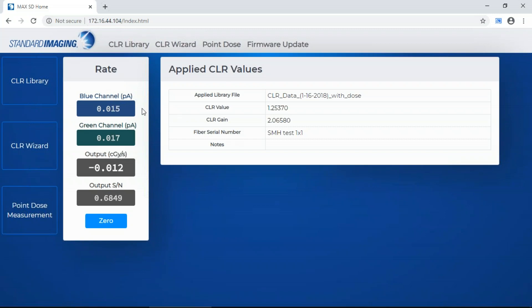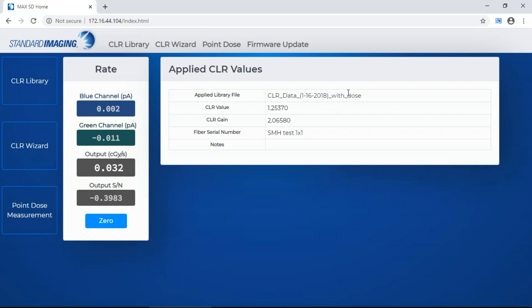The home screen shows me raw values that are being measured right now — this is just background noise, I don't have radiation here to show you measurements. It shows you the Cherenkov light ratio, which is the correction factor from those characterization measurements, and which of those saved files is being applied. Because we have a dose calibration, it will show you output in terms of dose.